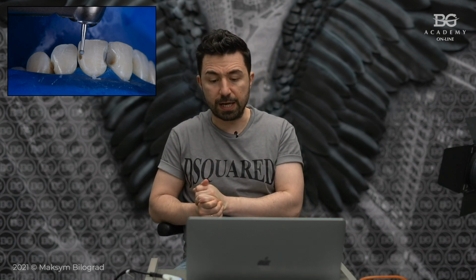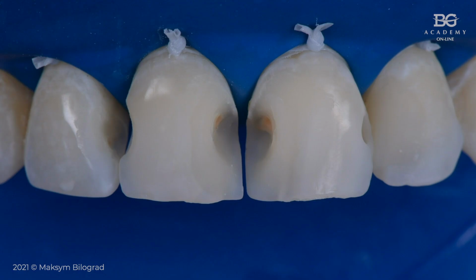Another thing is, after that I provided sandblasting, and you can see that there are some particles, some portions of composite that stayed. I observed and examined that portion of composite with a microscope, and I found that it was pretty nicely integrated, so I decided not to remove the whole composite restoration. I removed the areas around dentin where there was the caries, and the rest I decided to keep. And after sandblasting, you'll be able to add your new composite there, and to bond too.